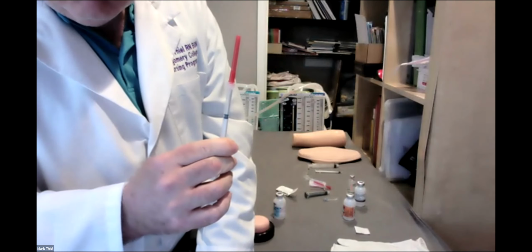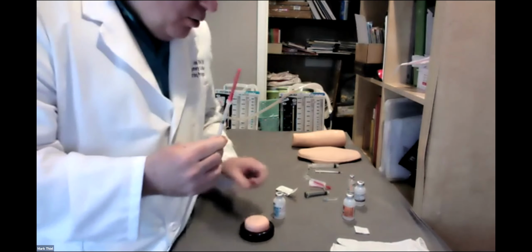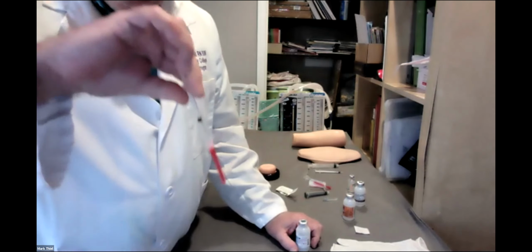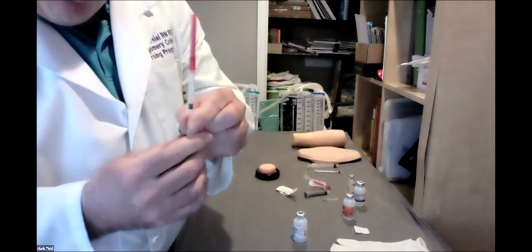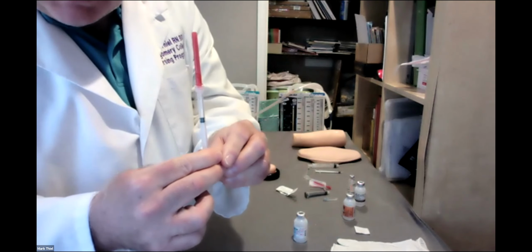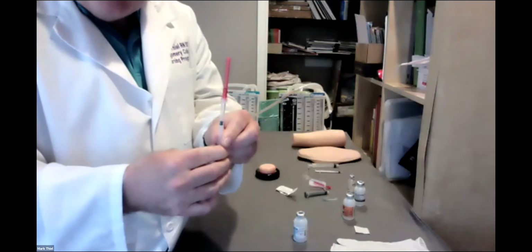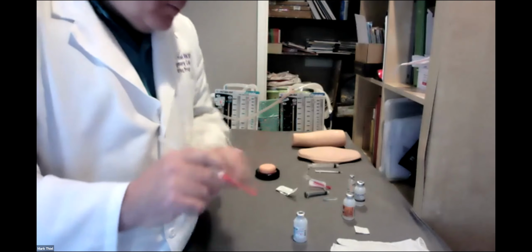Luer lock. Locked in to the blunt. In preparation for injection into the vial of medication, we draw my dosage amount, 0.5 in this case, of air. We draw air into this. I'll show you in a moment why.